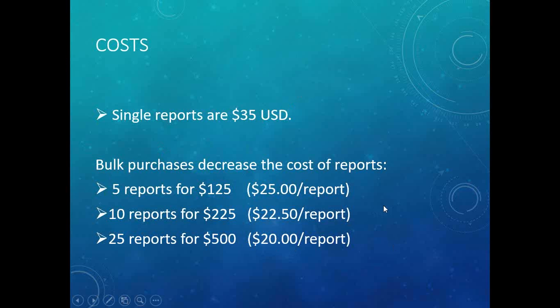And so we're really excited to be able to have this new website online and to make this amazing feature available to all of you at such a nominal and low cost. When we look at the other services where people interpret data for you, interpret your reports, it comes up to like $60, $80, $100 or more US. And so we thought that was a bit crazy, and this has to be more realistic. So clinicians all over the world would be able to use it and not just be priced out of the market and not be able to take advantage of something that's so good and easy at explaining things to them and to their clients.